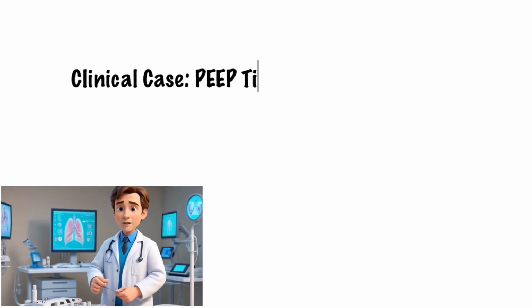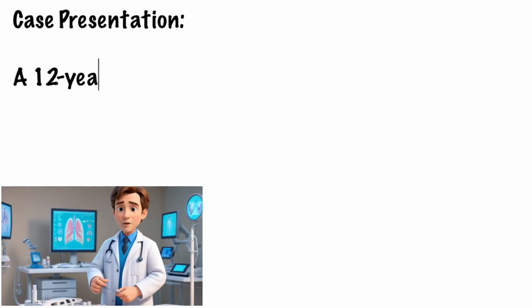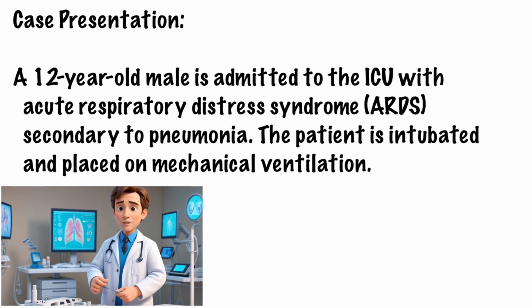Clinical case, PEEP titration using pulmonary mechanics. Case presentation. A 12-year-old male is admitted to the ICU with acute respiratory distress syndrome, ARDS, secondary to pneumonia. The patient is intubated and placed on mechanical ventilation.